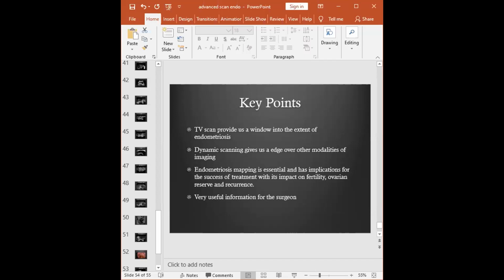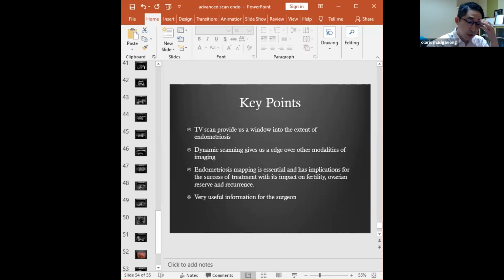I see. Thank you, Dr. Pasama. So in your opinion, Dr. Fong, compared with the MRI, do you do the routine MRI for the patient? No, I mean, the 2016 consensus paper says that transvaginal ultrasound should be the first modality of assessment. Only when we can't see, or sometimes we cannot do a transvaginal, for example, in single or young girls, then you are forced to do an MRI.